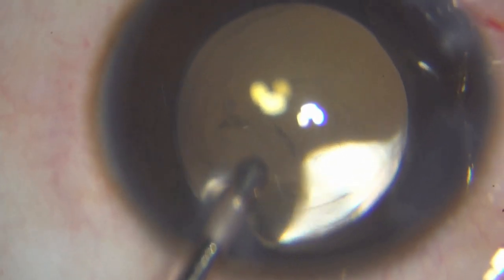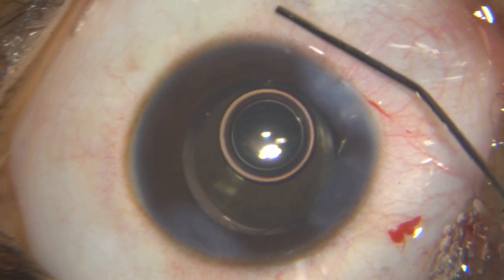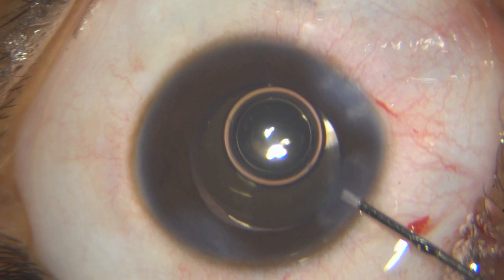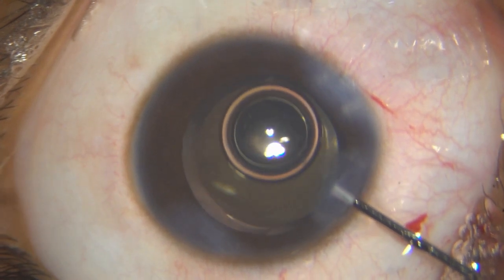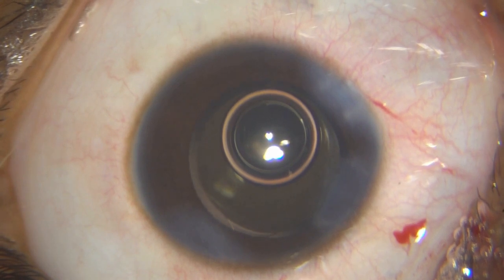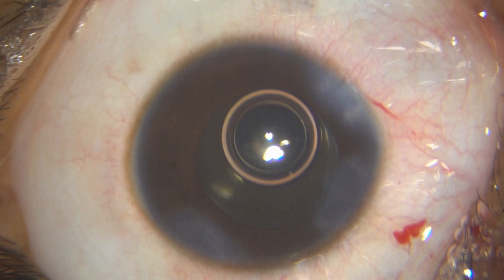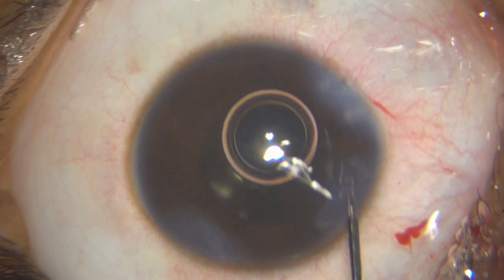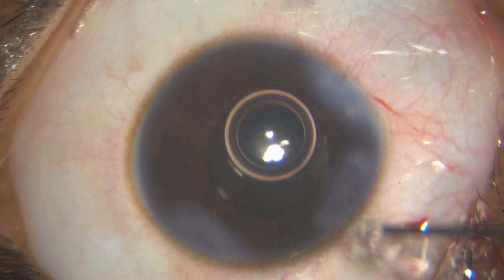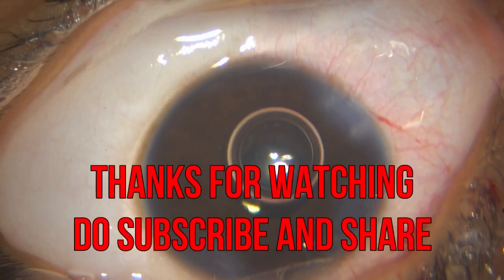Once all is done, I pressurize the chamber and hydrate the wounds. I have put in some pilocarpine — I don't want this optic to be captured by the pupil the next day. I have also put in my intracameral antibiotic, and with this I conclude my surgery. Thank you so much for watching.